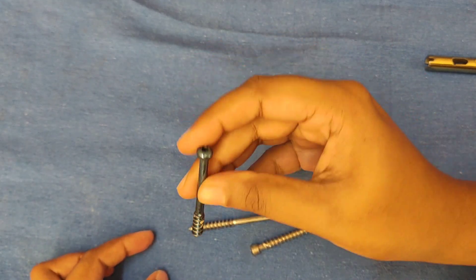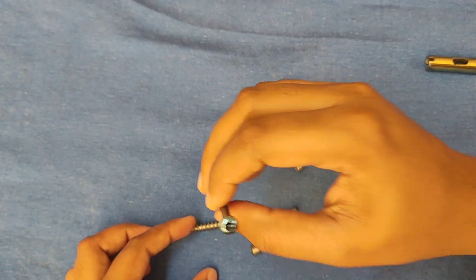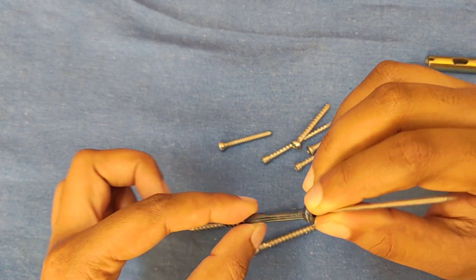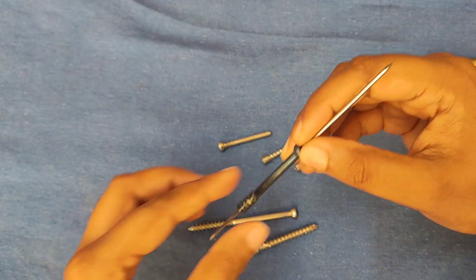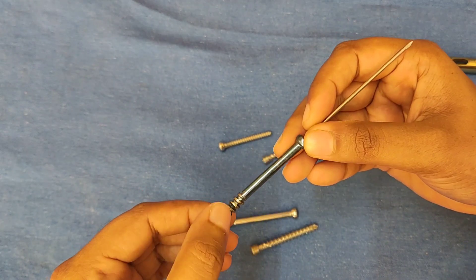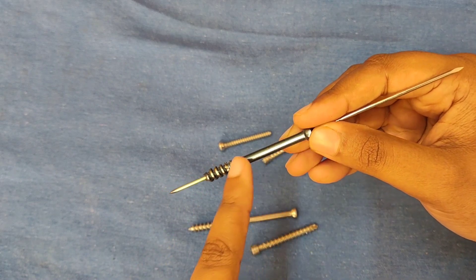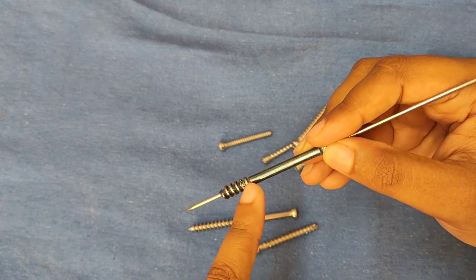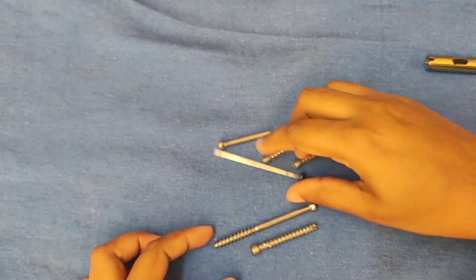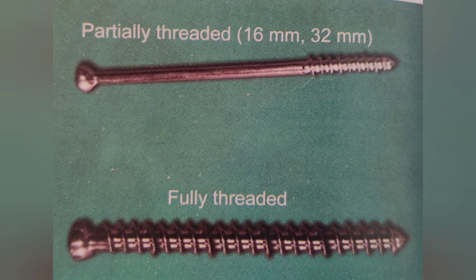Next is a partially threaded cannulated cancellous screw. Earlier, malleolar screws were partially threaded cortical screws of 4.5 mm diameter. At present, partially threaded 4 mm cancellous screw has taken its place. Here you can see a K-wire can easily pass through the screw.